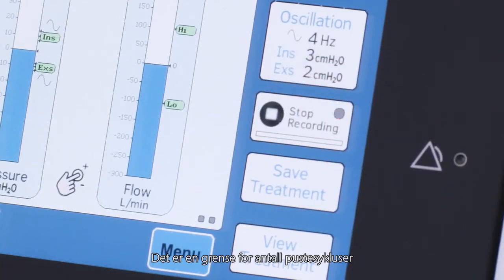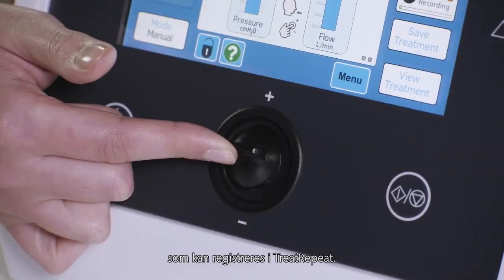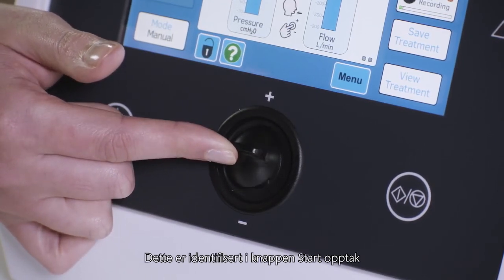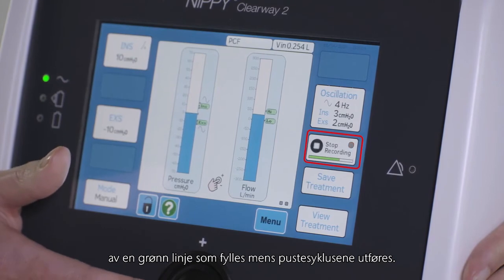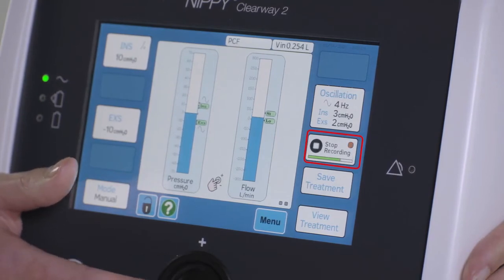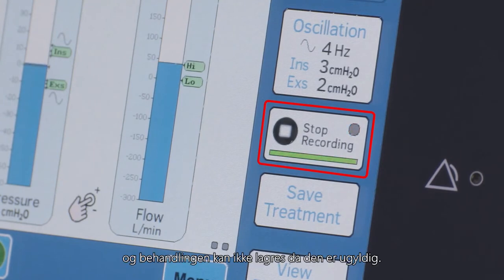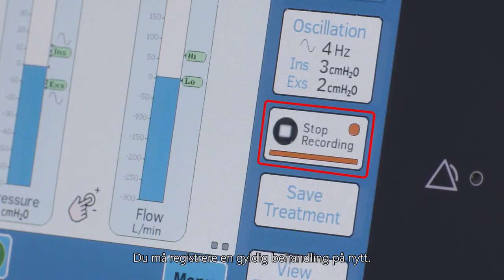There is a limit to the number of switch movements that can be recorded in Treat Repeat. This is identified in the start recording button by a green bar that fills as switch movements are made. If too many switch movements are recorded, the bar will turn red, and the treatment cannot be saved as it is invalid. You will need to re-record a valid treatment.